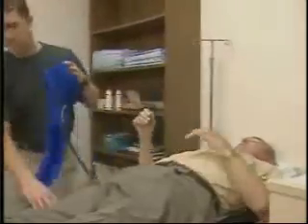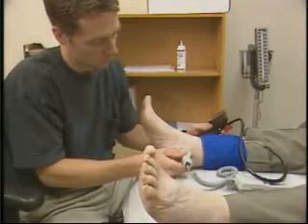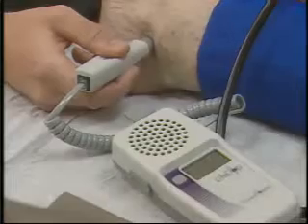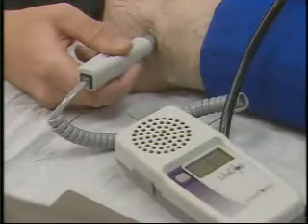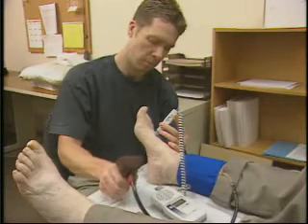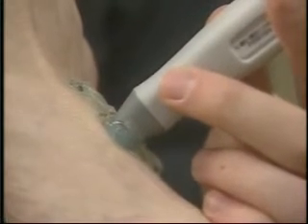The ankle pressures are obtained by wrapping the cuff snugly around the ankle and placing the Doppler probe over the posterior tibial artery on the inside of the ankle. Using the same protocol as you did on the arm, inflate the cuff until the Doppler sounds disappear, then slowly deflate until the sounds are heard again. Record that pressure and deflate to 0. Repeat for the other leg. On some patients, it may be easier or necessary to use the dorsalis pedis artery on top of the foot.